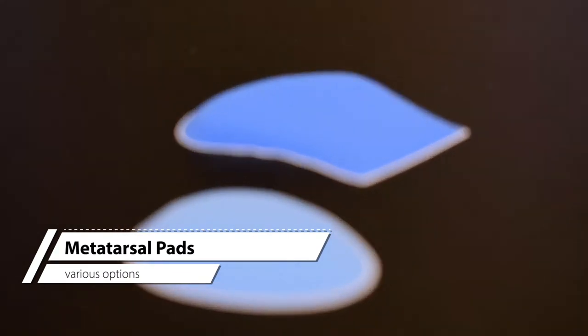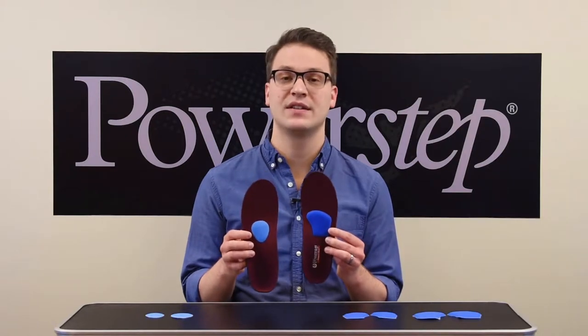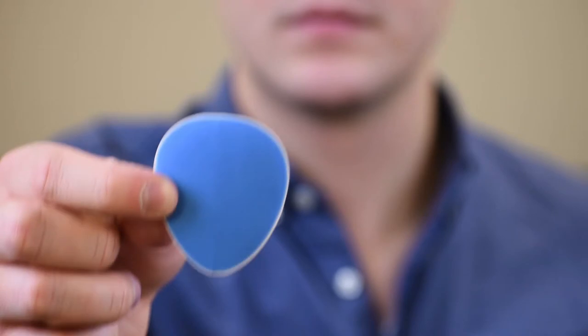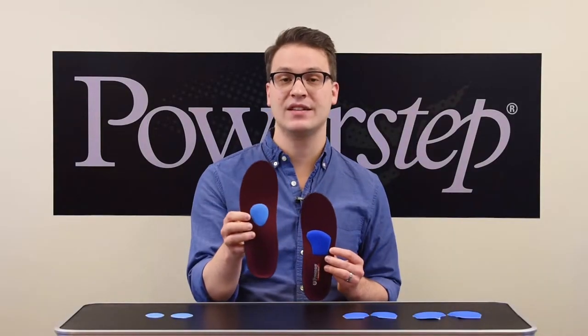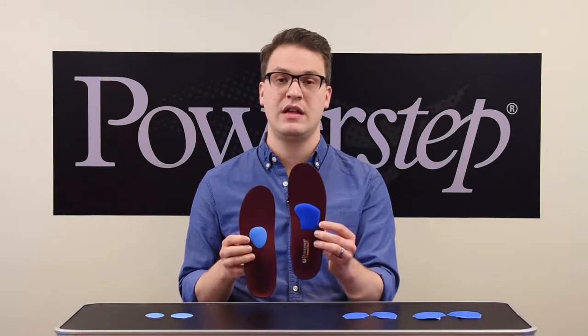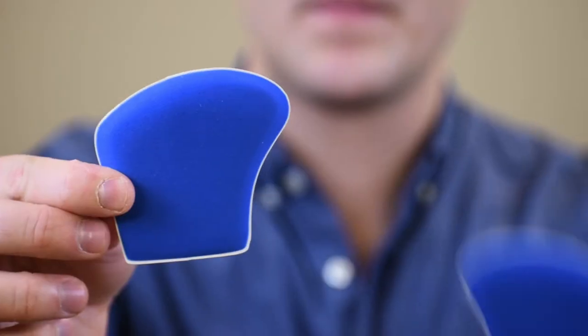Metatarsal pads are used to cushion and spread the metatarsal heads to alleviate forefoot pain like metatarsalgia and Morton's neuroma. We have two different styles: a met teardrop pad and a met cushion. The met teardrop pads are lower profile, while the met cushions have a more prominent shape. These both come in small and regular sizes, and the met cushions are left-right specific.